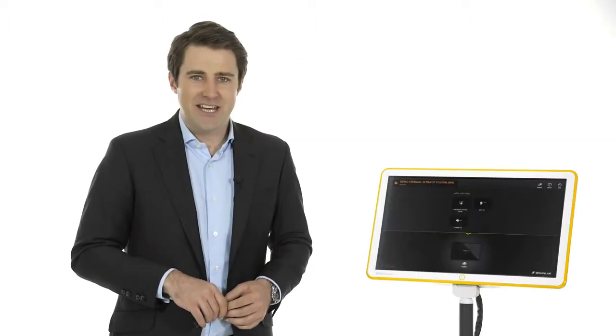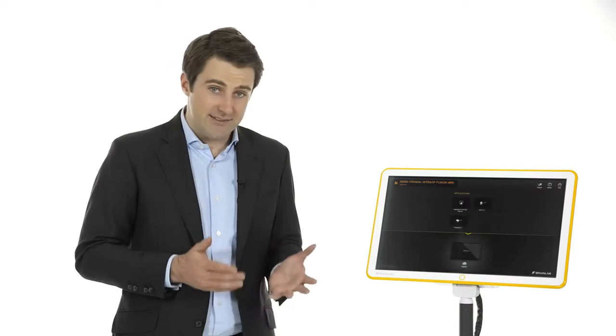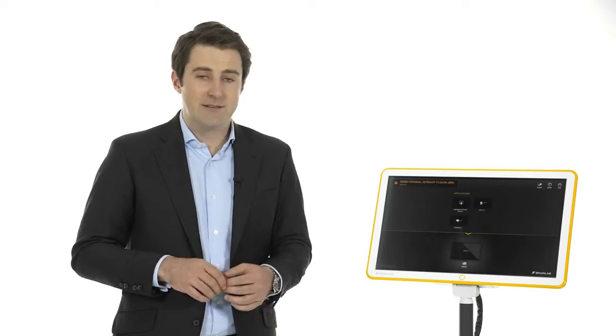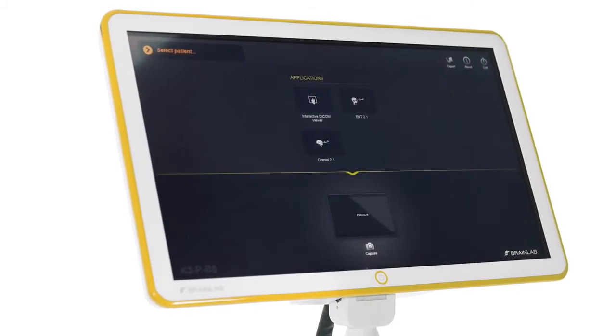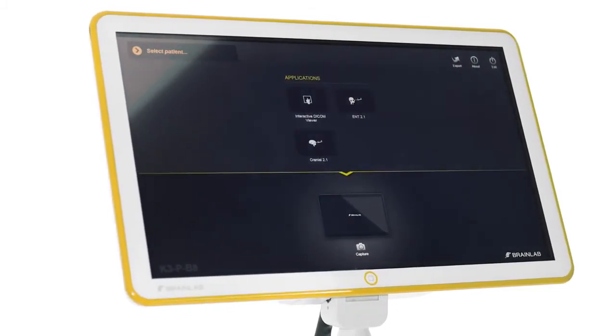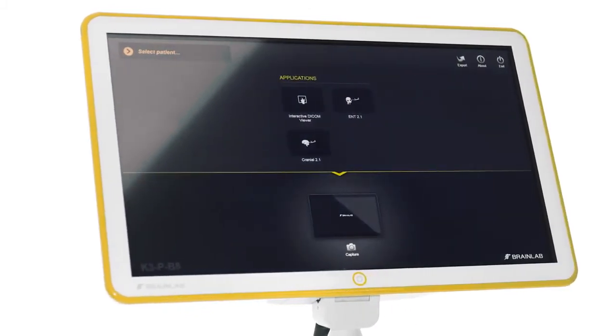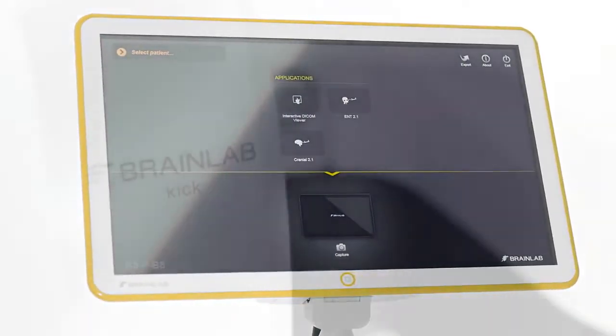KIK is the navigation system of choice for practitioners seeking simplicity and flexibility. The neatly engineered design makes the system's advanced capabilities fade into the background, leaving the focus on the user-oriented interface of KIK.